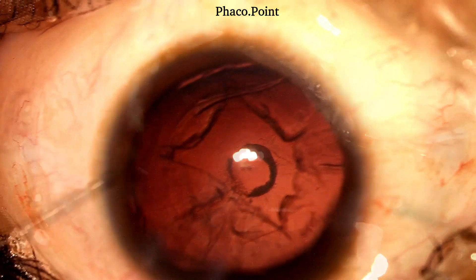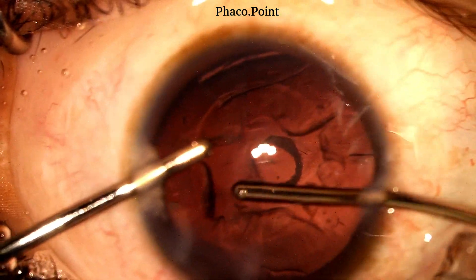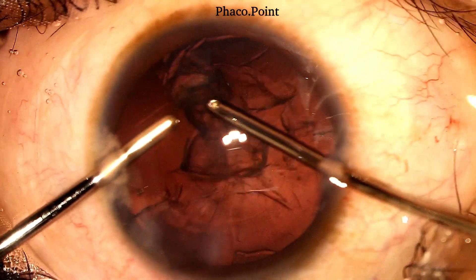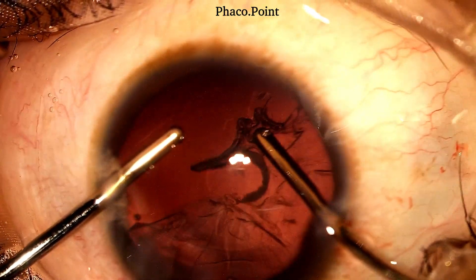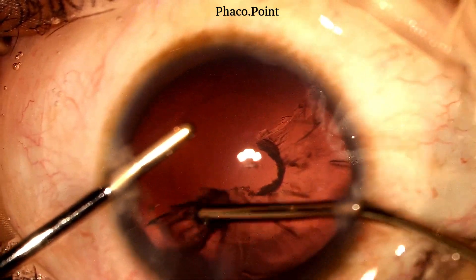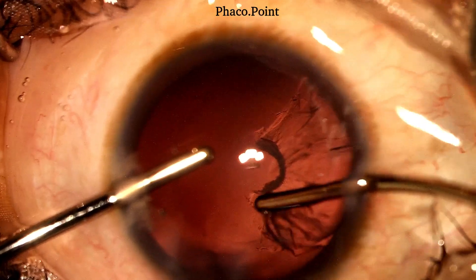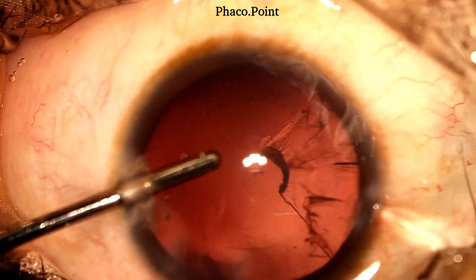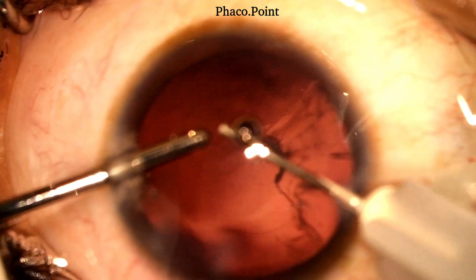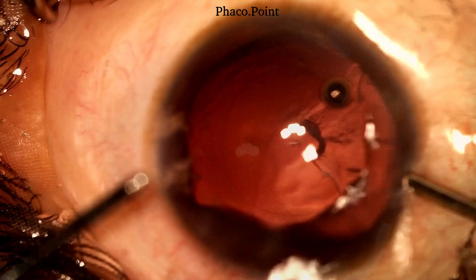The same principles are followed while performing bimanual irrigation aspiration. Each time the irrigation has to be brought out of the eye, the surgeon performs a visco-fluid exchange prior to removing the irrigation. Note how as the viscoelastic starts to fill the anterior chamber, the irrigation is turned off and then removed from the eye.